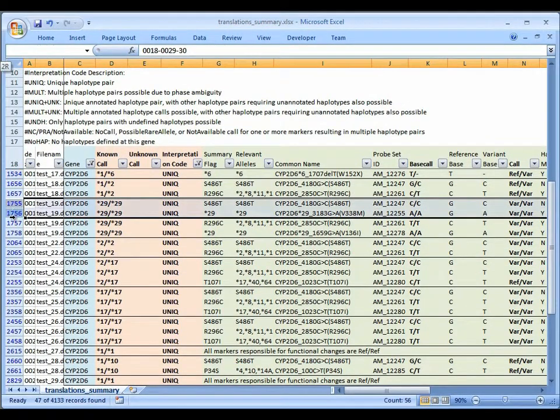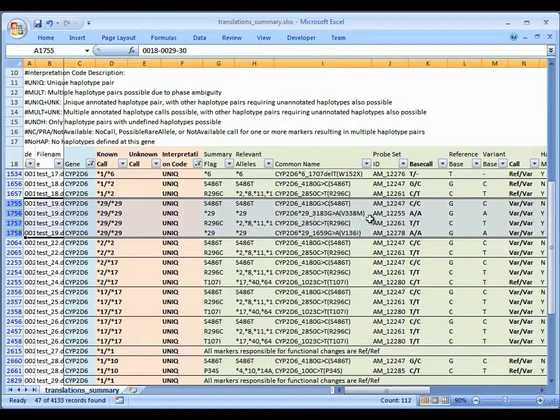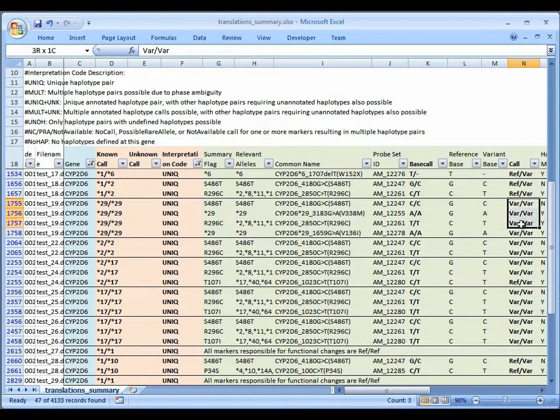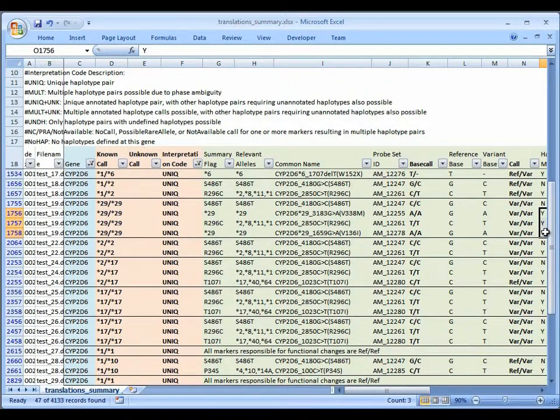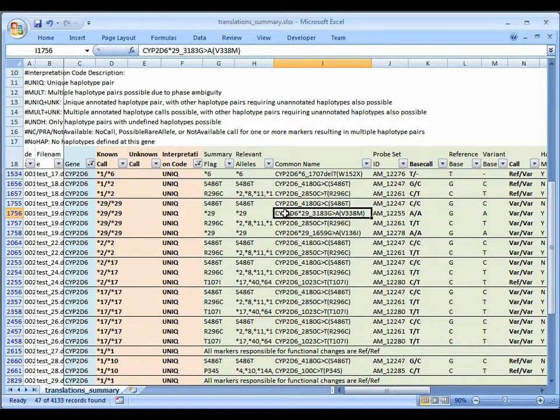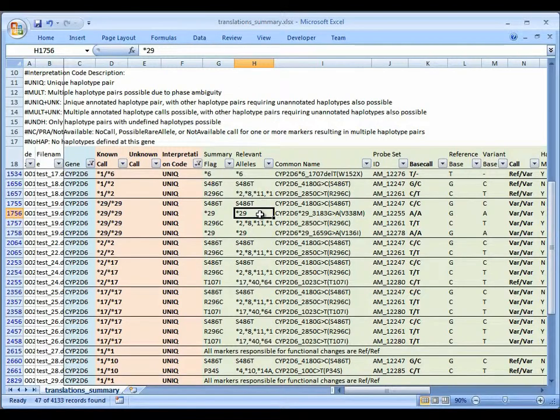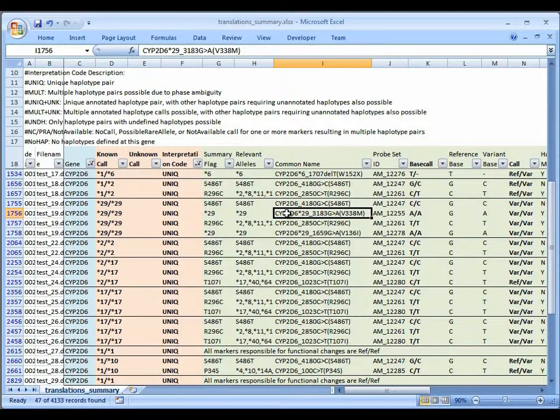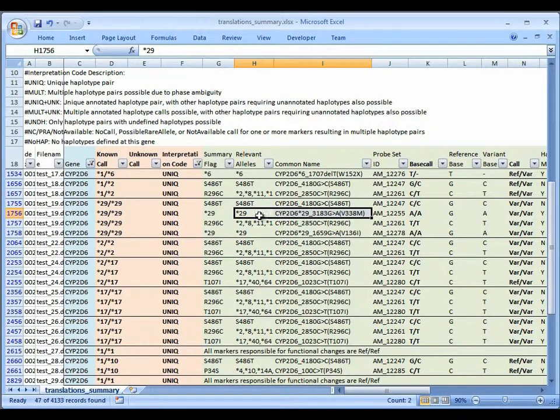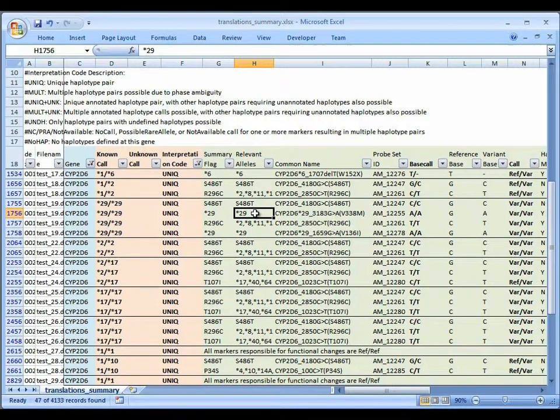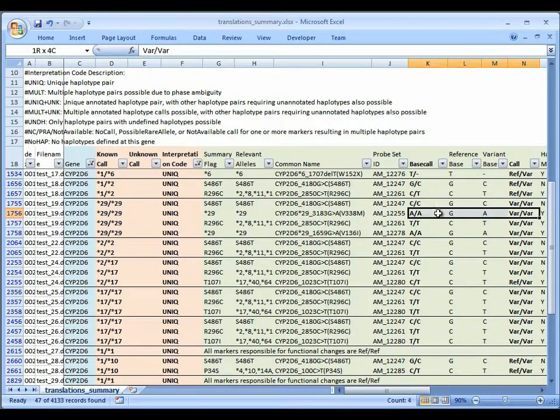Let's look at one where we've got more markers. So, star 29, star 29. For this sample, we have four markers that are calling variant variant, three of whom are used for haplotyping. So, let's see if we can predict the star 29, star 29 call. This relevant allele column specifies which alleles this particular marker can be variant in. For this particular example, when this marker is a variant, it appears only in the star 29 allele. Therefore, this marker by itself can be used to make the star 29, star 29 call because we are homozygous variant.